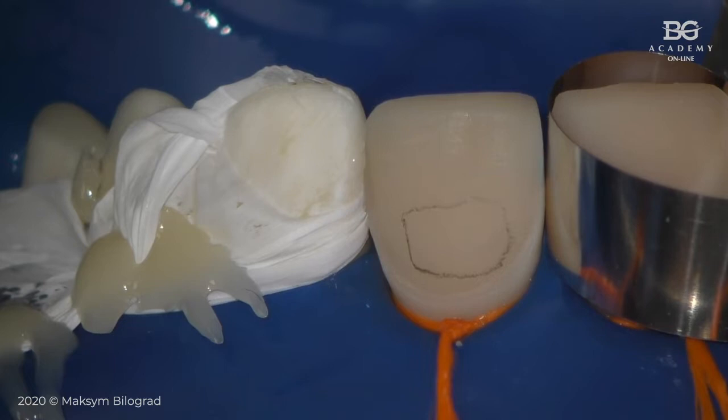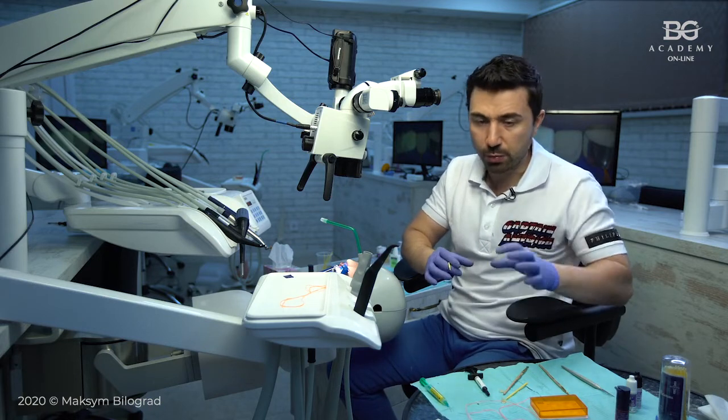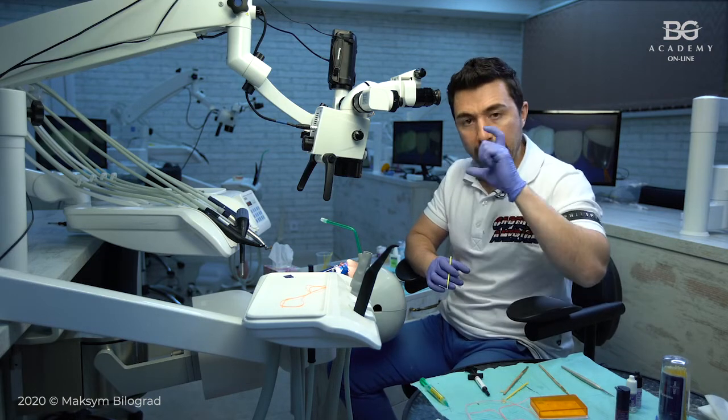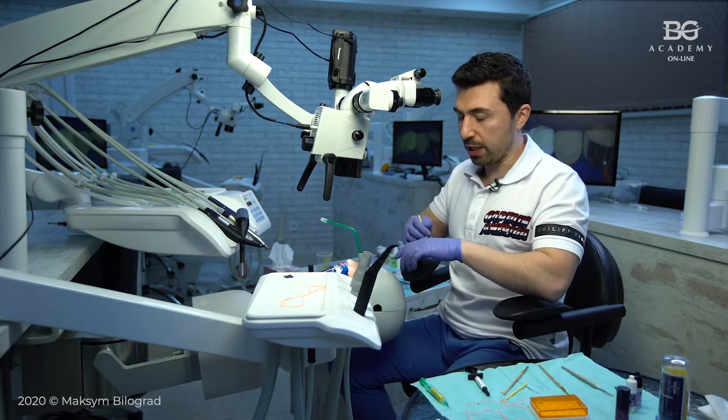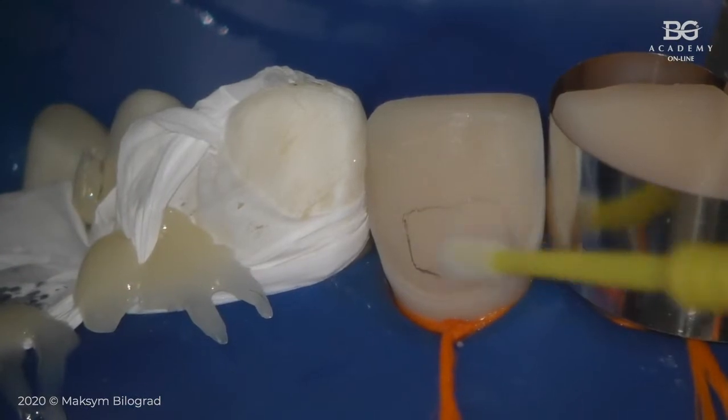And then after that, what I'm doing, if I'm using fourth generation of adhesive system, I'm taking primer. Okay, the fourth generation of adhesive system is when you have separate primer and separate adhesive. I'm taking primer, the first bottle. I will put my primer here, and I will massage for 20 seconds in the area of dentin.